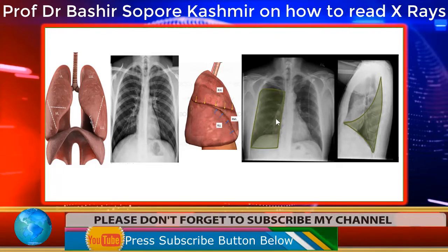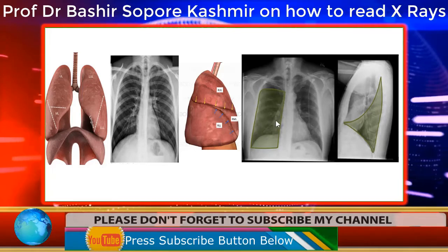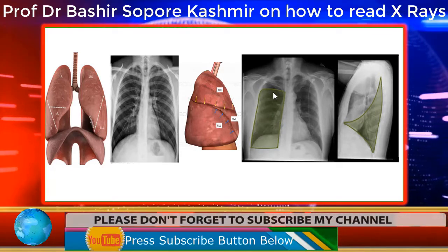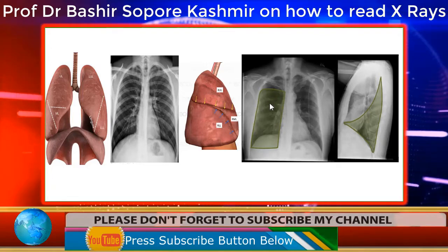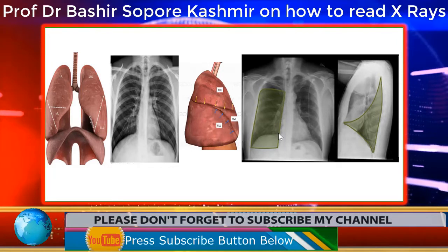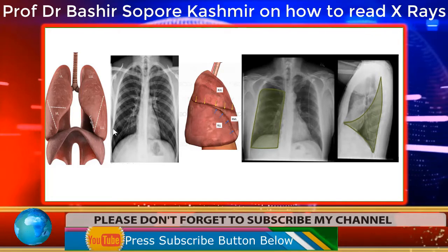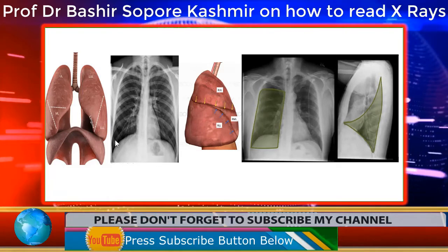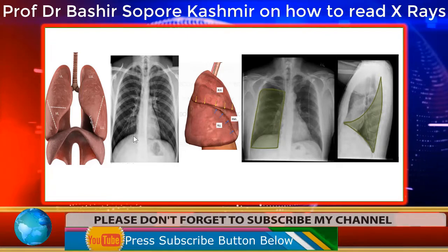Because you may raise the question, sir, if it is the lower lobe, then why are we not able to see the middle lobe? You got the point. Now this will also depend upon the extent of the disease, the extent of the lesion, right? And the most important thing in the lower lobe is that, as I said, the lower lobe touches the diaphragm. So we will not be able to see the diaphragm. And the costophrenic angle is this one here. So it will be obliterated. So in lower lobe pathologies, the costophrenic angle is obliterated, right? And the diaphragm will not be clear.